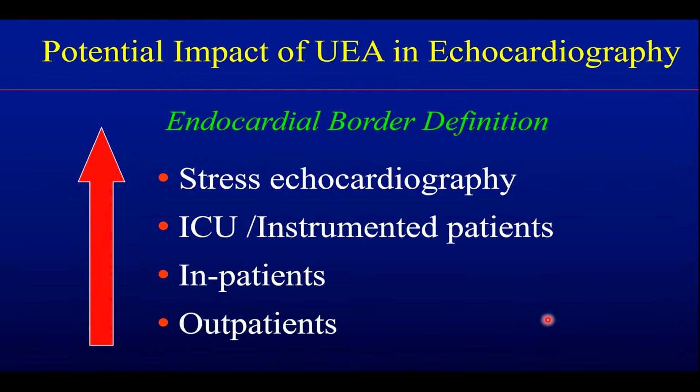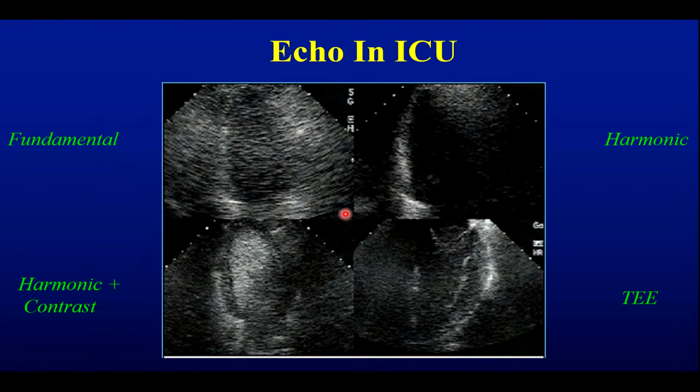The impact is most likely in this situation. I haven't changed this slide for years. Unless you're dealing with a lot of COPD or special populations, most often you're not going to use contrast in a regular resting echocardiogram, more in the inpatients, more instrumented patients, and for stress echo, we'll talk about that, okay?